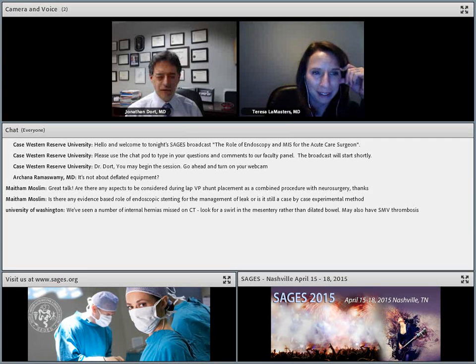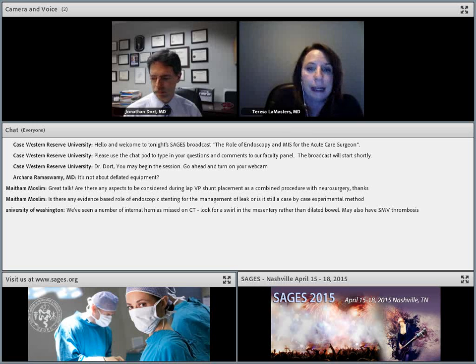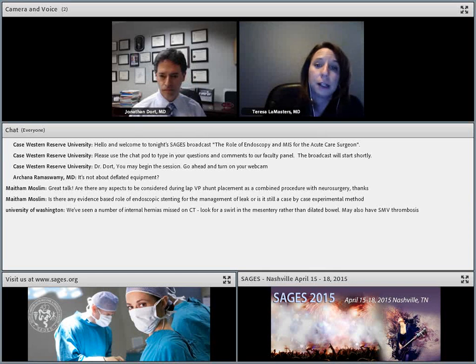So let's see, what do we have? The next question discusses the findings of internal hernia missed on CT. I really wish I would have had time to find you some great classic pictures. This is really a case where you need to look at the CT yourself. If I was going to tell you my clinical experience, 90% are missed on a CT read by a radiologist, despite education, even for the radiologists who work with us all the time.